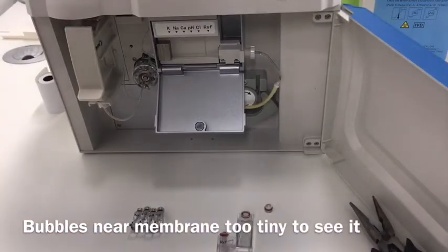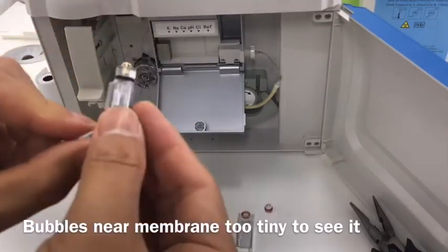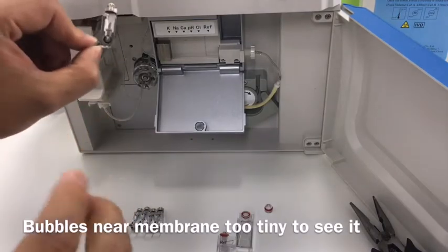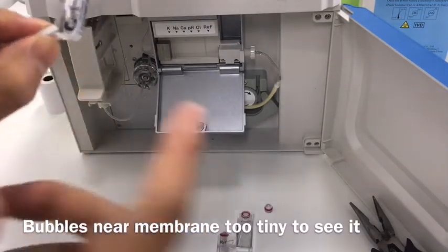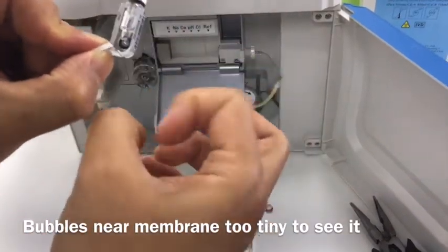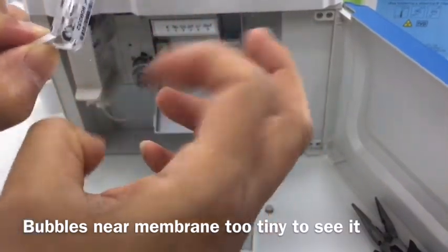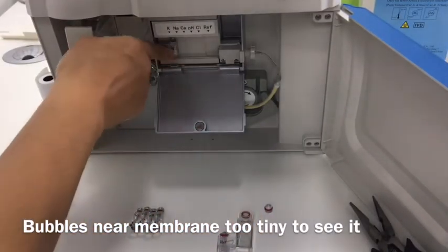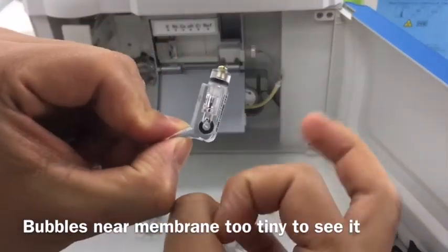Now let's do the installation for electrodes. This is the normal electrode. We hold it in this position and there must be tiny bubbles inside that we can't see. We hold it like this and use our finger to flip the bottom of the electrode. We need to do it firmly to remove the tiny bubbles. You have to do this before installation for each electrode.